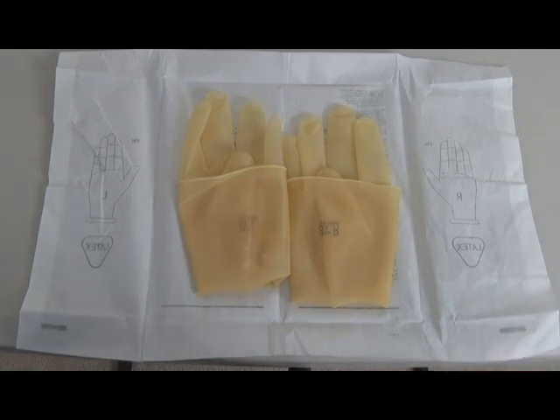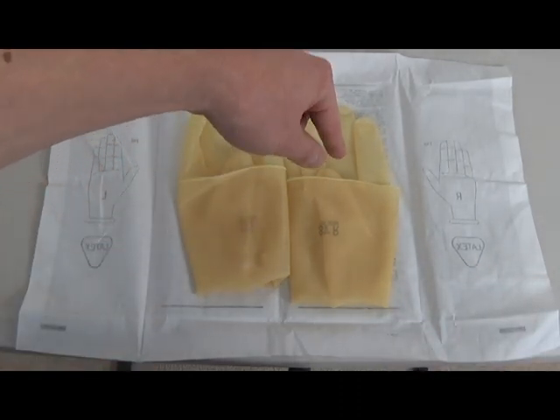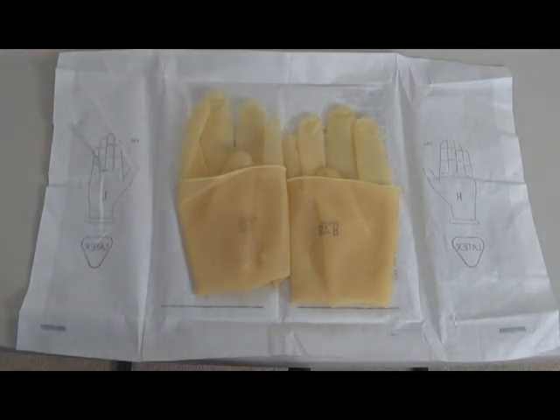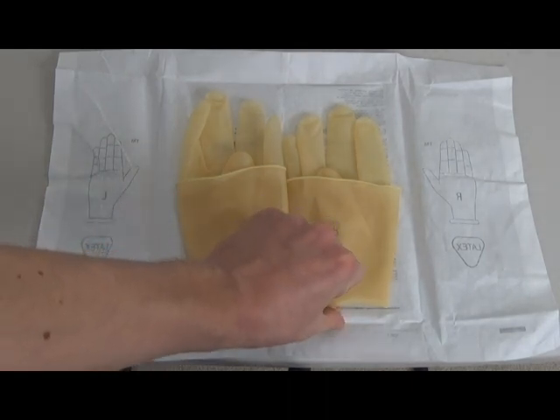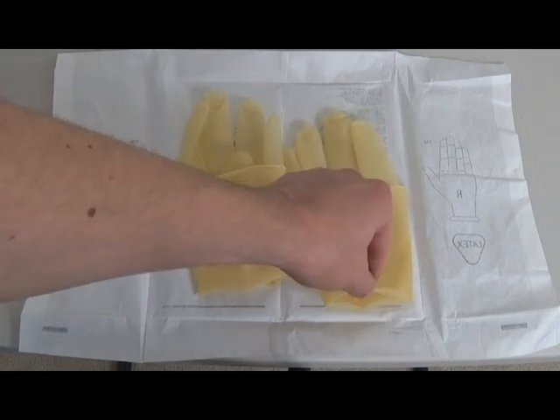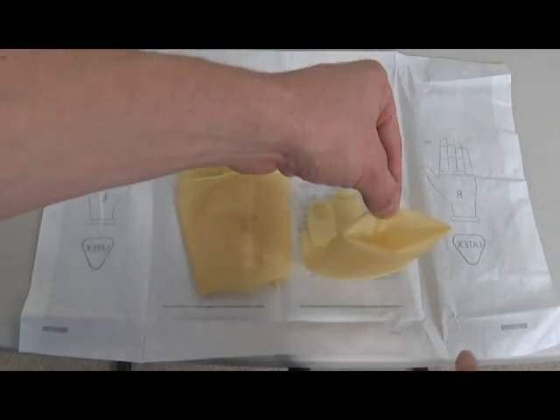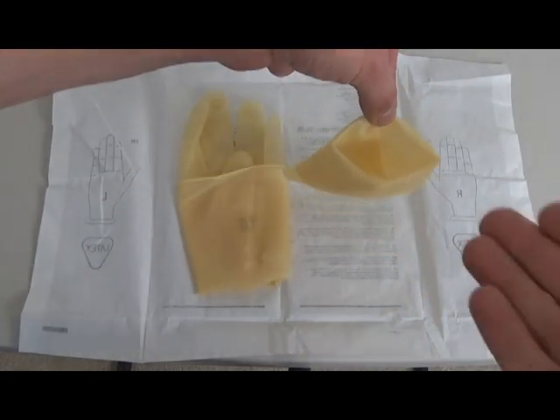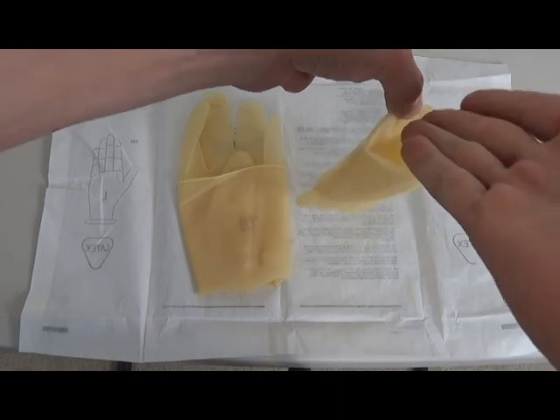Now the right glove, I put it on a little bit differently than my left, and you'll see why in a second. So, another mistake: people like to grab the glove from this edge. You can't do that. That's sterile right here. At least while you first put the first glove on, you can't do that. Where do you grab? At the bottom right here. And remember, as you pick up the glove, don't slide it. This down here is kind of questionable. When you pick it up, you want to lift it straight up. Now you can also see where exactly my hand is going to go.